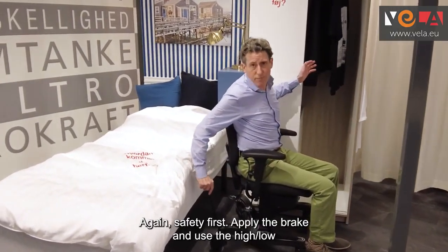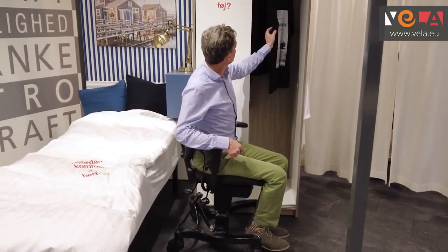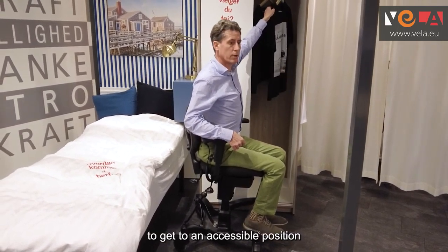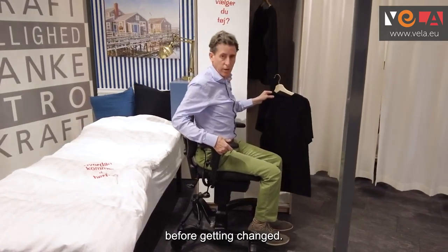Safety first — apply the brake and use the high-low to get to an accessible position to grab any clothing you might need before getting changed.